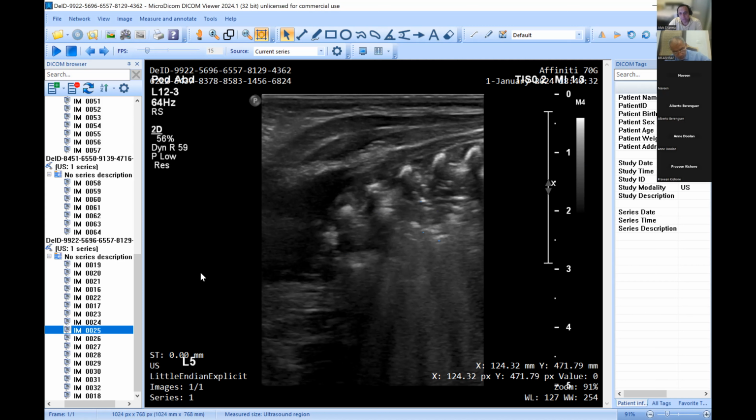On the other hand, if this is a baby that's working really, really hard, or the FiO2 is 40-50%, you want to optimize recruitment here, to reduce your FiO2 and the effect it's going to have on the eyes, as well as the lungs. So it's really about clinical correlation. What you might find is that if this baby is prone, you repeat this after a few hours, and you might find that area is well recruited. With babies who have evolving chronic lung disease, this happens all the time. So it's really about clinical correlation.